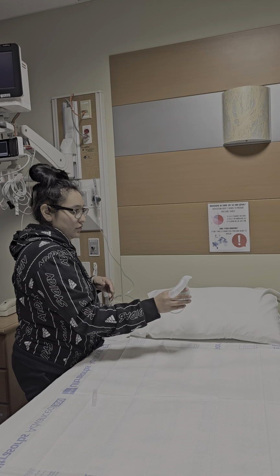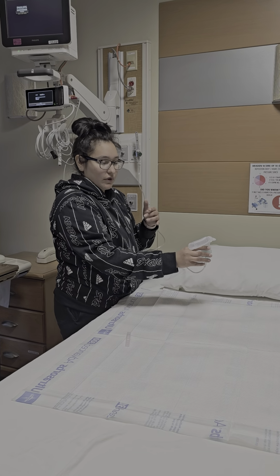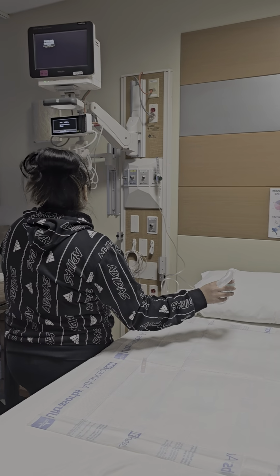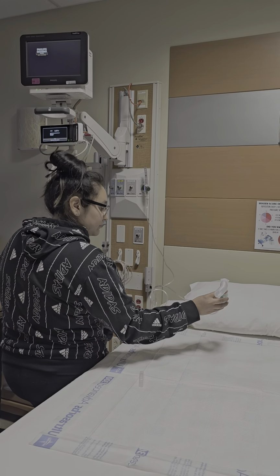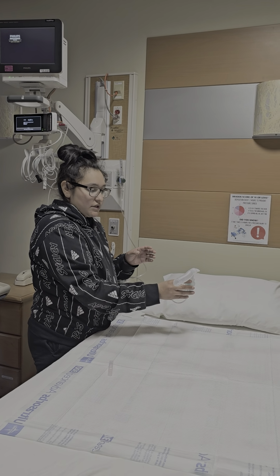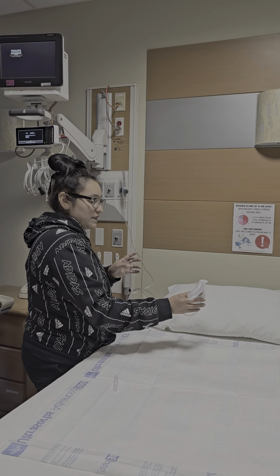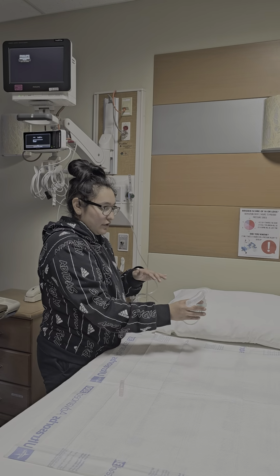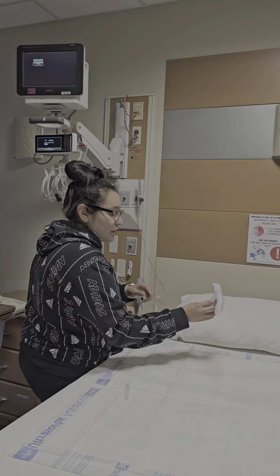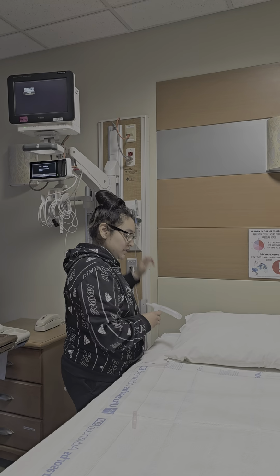Throughout the procedure, you'll want to instruct them to breathe normally with occasional slow, deep breaths with inspiratory holds. You'll also want to be monitoring their vitals throughout the procedure. If you assess any adverse reactions, then you'll want to stop treatment. For asthmatic patients, we will have to do a peak flow before and after the procedure. Once you hear a sputter, then the treatment is done, and you can discontinue it.